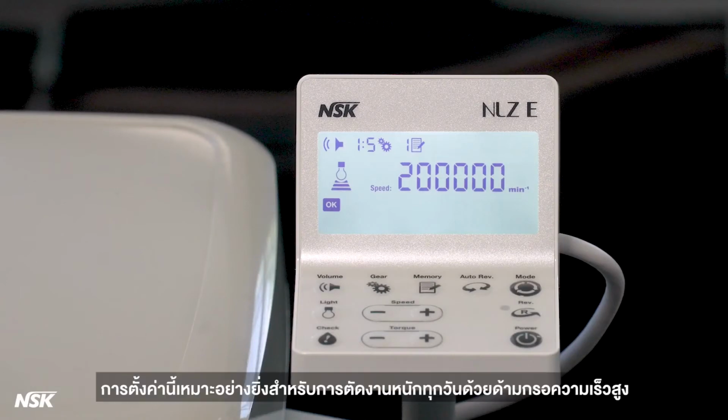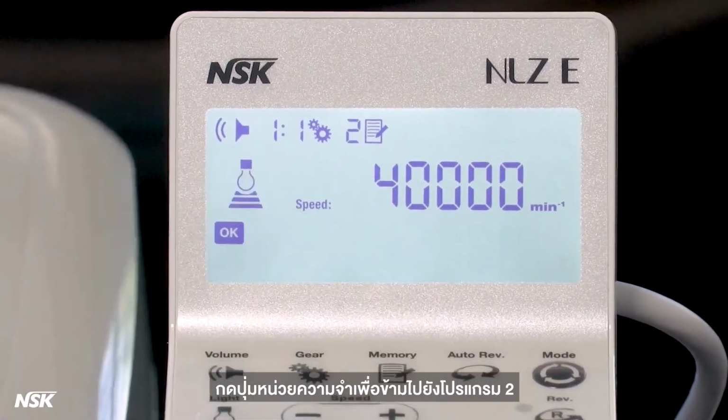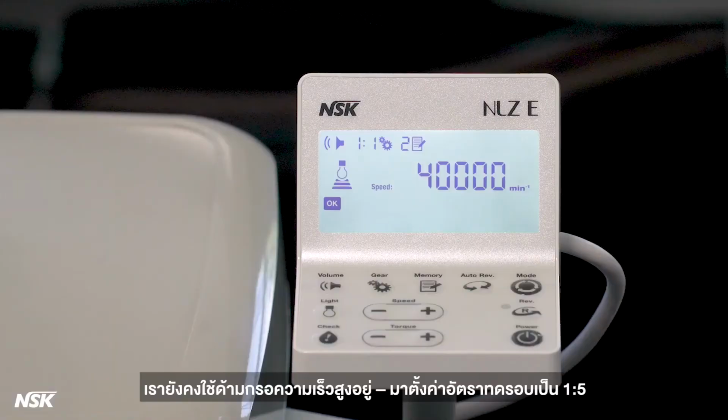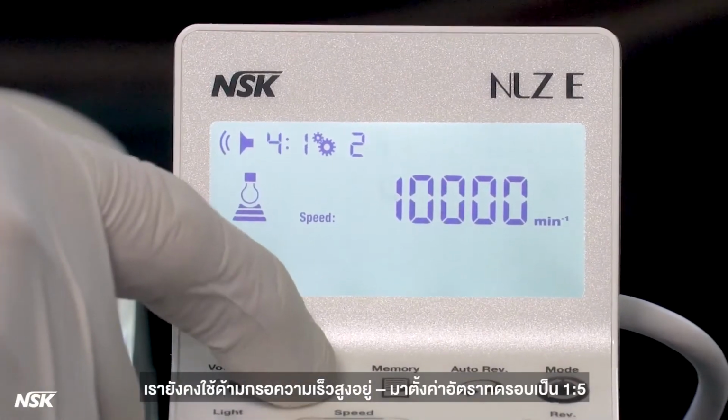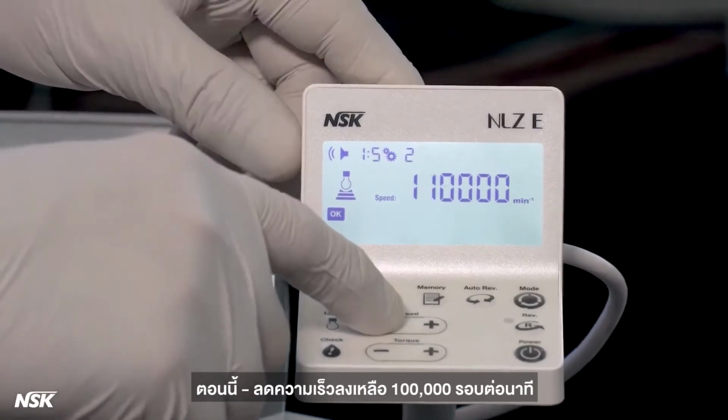This setting is ideal for everyday heavy-duty cutting with a high-speed attachment. Press the memory button to jump to program number 2. We're still using the high-speed attachment. Let's set the gear ratio to 1 to 5. Now, dial down the speed to 100,000 RPM.